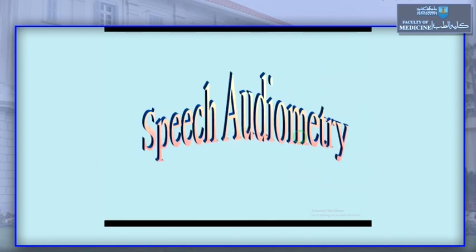By this, I have finished the pure tone audiometry. And now I proceed to the second test, which is speech audiometry. Again, as the name entails, speech audiometry. Audio means hearing, metry means measurement, and we are using speech in order to measure hearing.